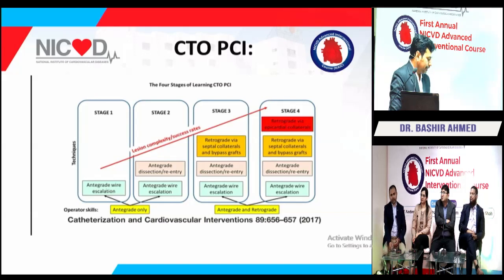And here it is mentioned regarding the epicardial that the rate of complications is higher, so it needs the expertise to deal with it.